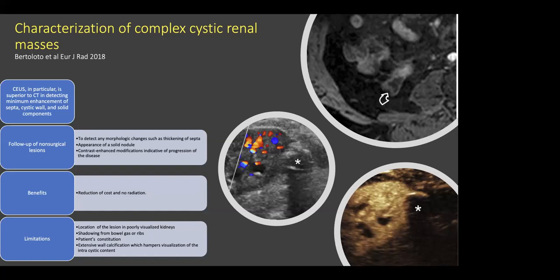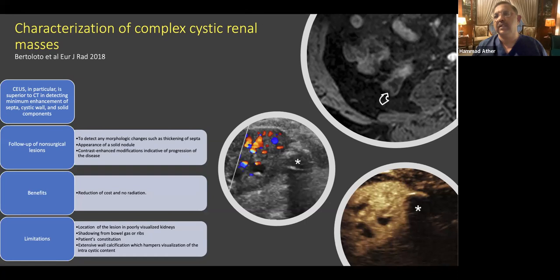One other limitation for most ultrasound examinations is the operator performing the ultrasound, because ultrasound is very operator dependent. Yeah, that's true, that's global for all kinds of ultrasound. Can you explain why contrast-enhanced ultrasound is probably more dependent upon a person's ability?